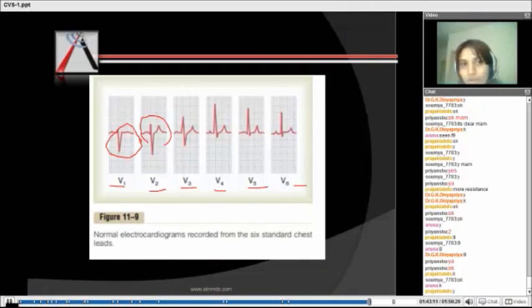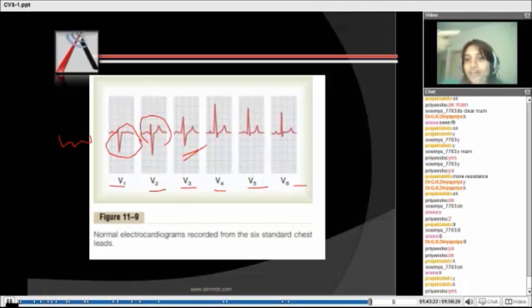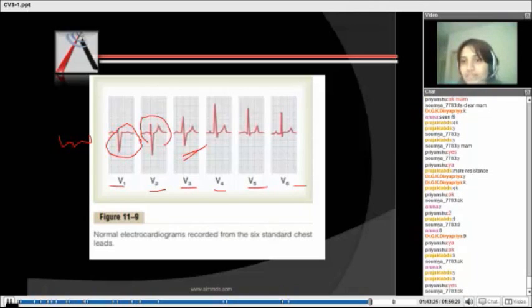This is the second point. And then the QRS wave starts becoming positive. Do you notice this? This point could be asked. When we talk about the chest leads, the first 2 have the reverse depolarization waves.